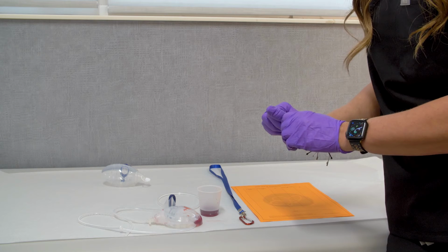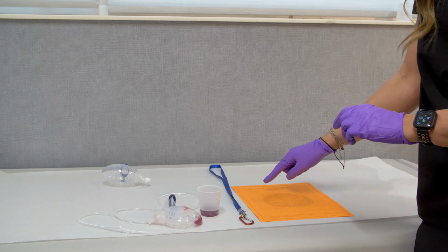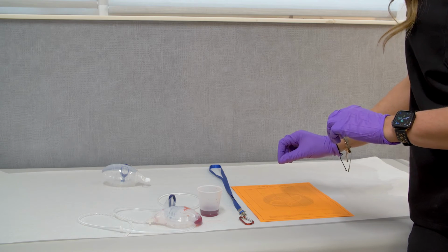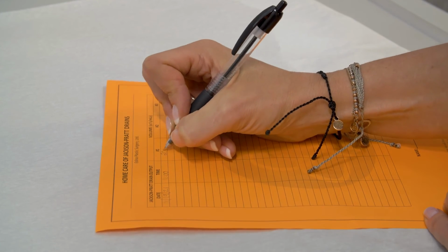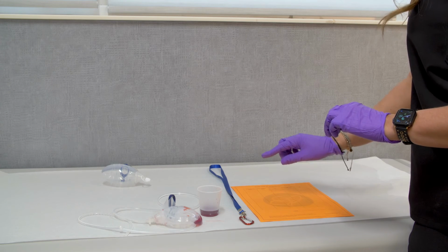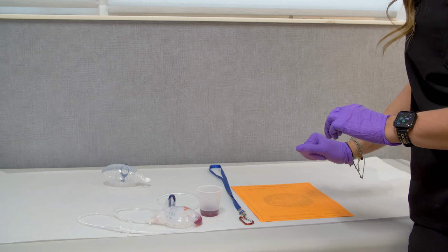What you then need to do is make sure that you are documenting the amount of drainage that you are getting out of those drains. Date, time, and the amount. Some patients will have more than 1 drain, so please make sure you mark it accordingly.